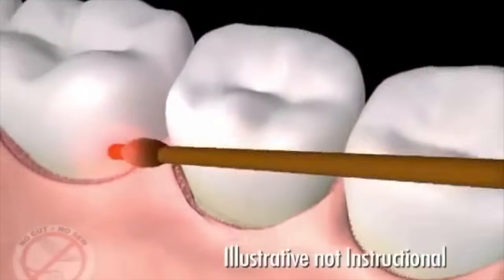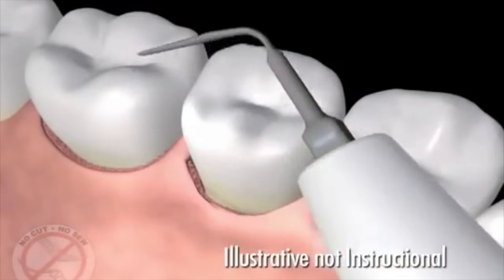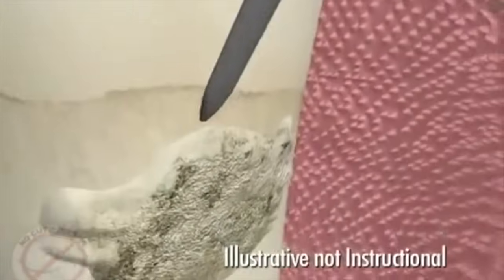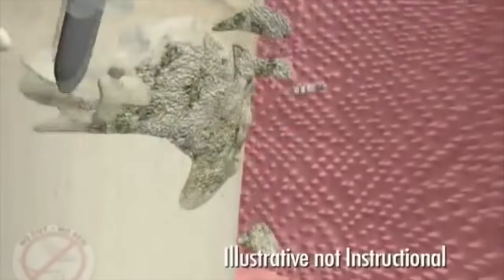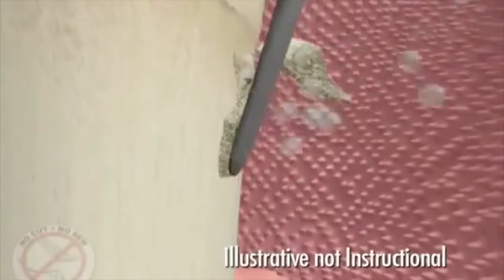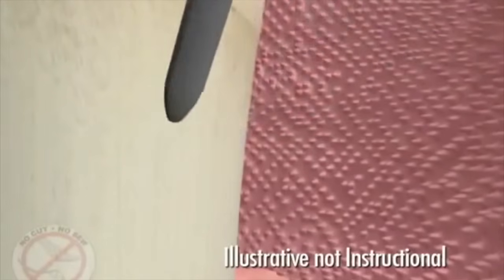The laser tip is then removed from the pocket and set aside. In the next step of the procedure, ultrasonic cleaners are used to remove the hard deposits we call tartar or calculus. These instruments use sound waves, vibrate, and break apart the hard mineral calcium deposits, with water flushing away the debris and cooling the instrument tip.